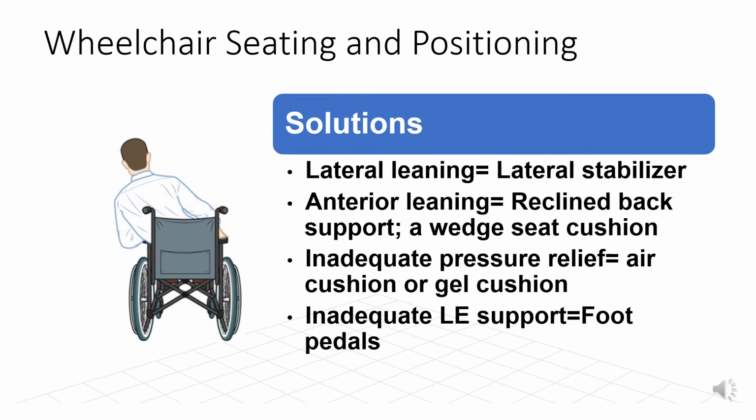Positioning issues affect patients in various ways. They do result in falls, compromised skin integrity, affect performance of self-care tasks, and result in increased care by staff members. There are various solutions to specific positioning deficits.